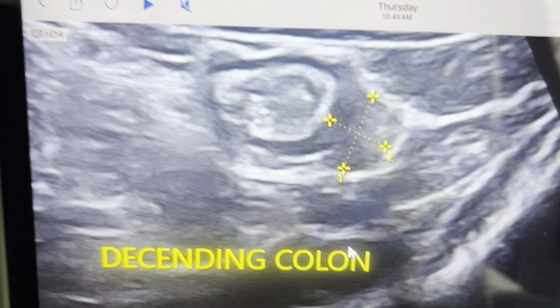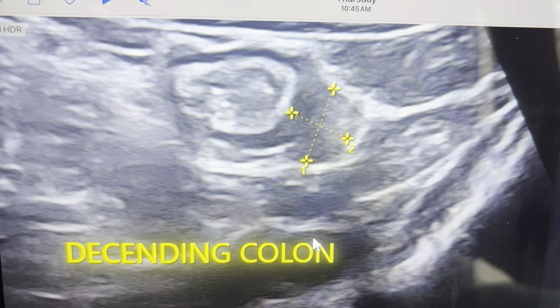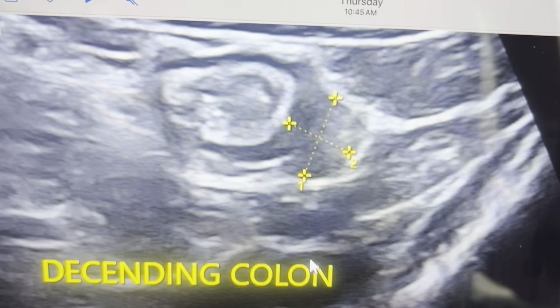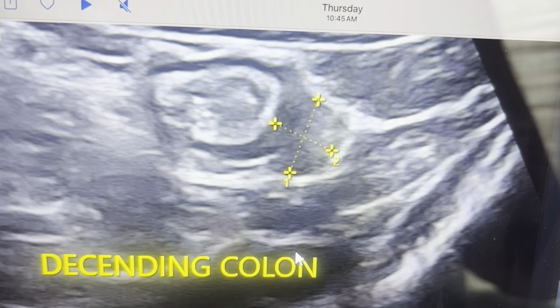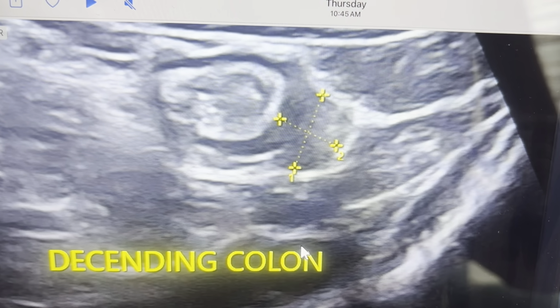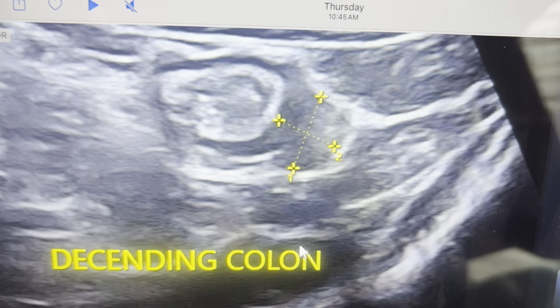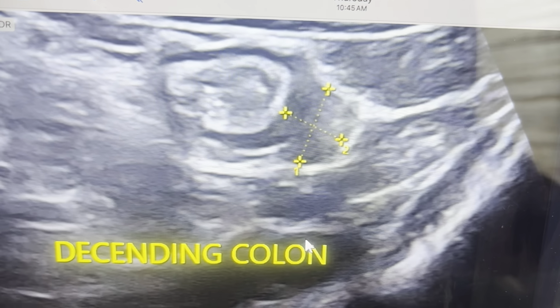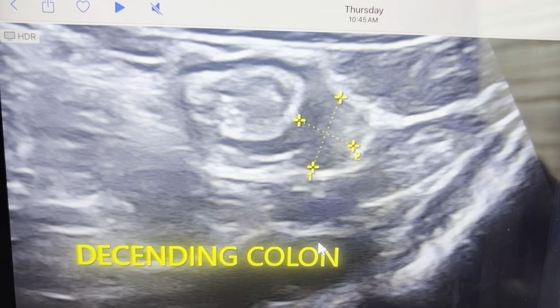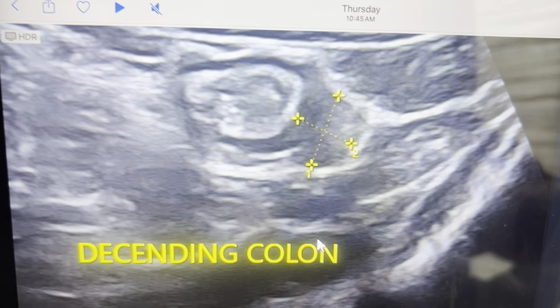So if you can scan and find this kind of finding, then you can save the time and money of the patient, and the time of the physician also, and help him reach this kind of small diagnosis which is not so important from a clinical point of view, but we can make the person aware and educate them about the right diagnosis.